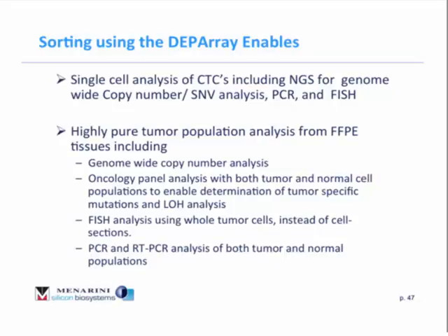And finally, for assays that require whole cells, the disaggregation technology enables us to do FISH on whole cells, whole disaggregated cells from FFPE tissues. And it's removing the sectioning artifact that you usually find with those tissues.